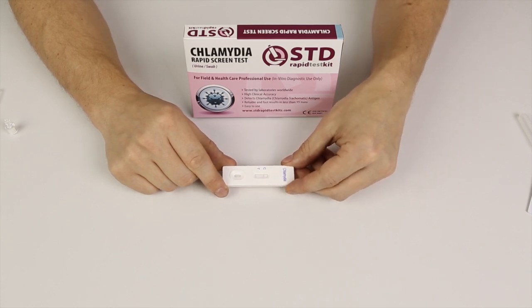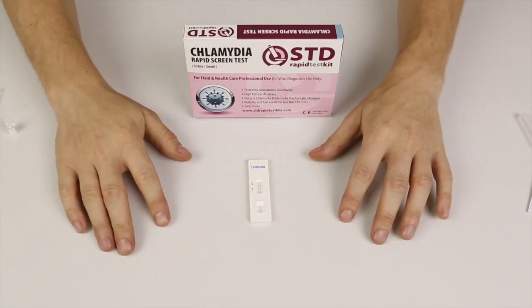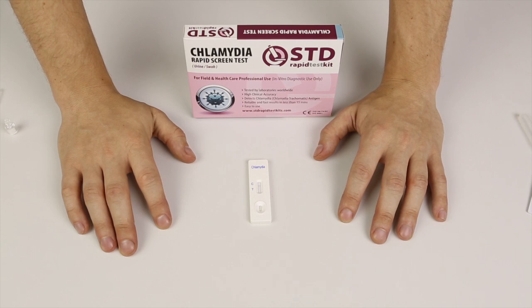It's also important that you do not read the results after 30 minutes. Chlamydia is a disease that cannot be left untreated. If you use our test kits and it comes out with a positive result, it is very, very, very important that you seek out professional medical advice.